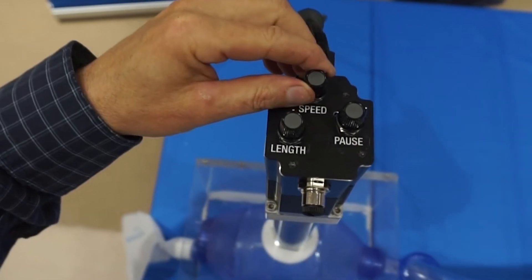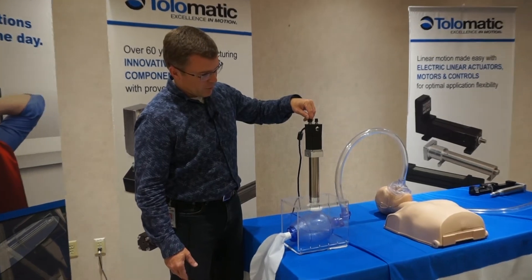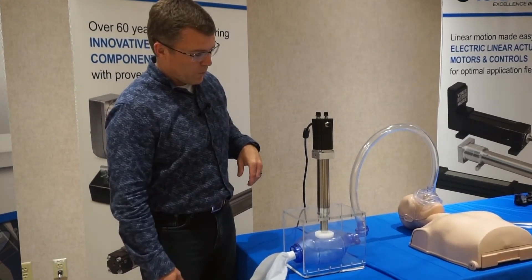I can adjust the speed with which it's moving up and down. So now it'll go a little faster — we're moving quicker so you get more cycles per minute.